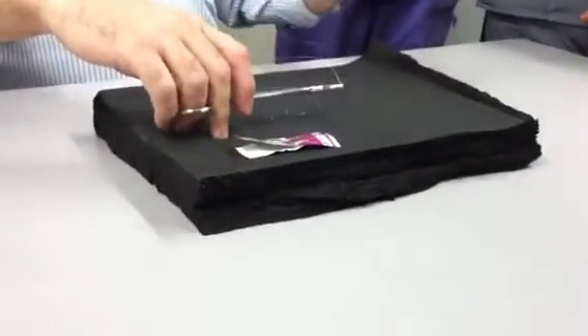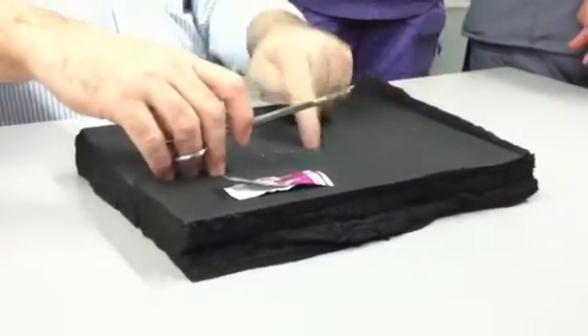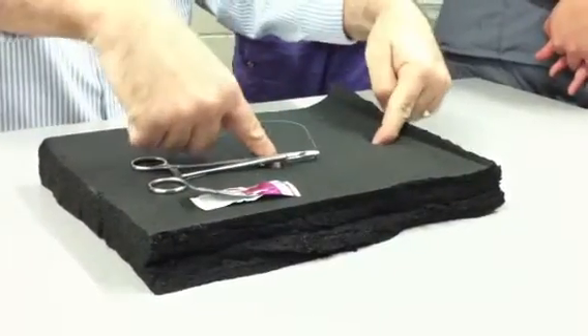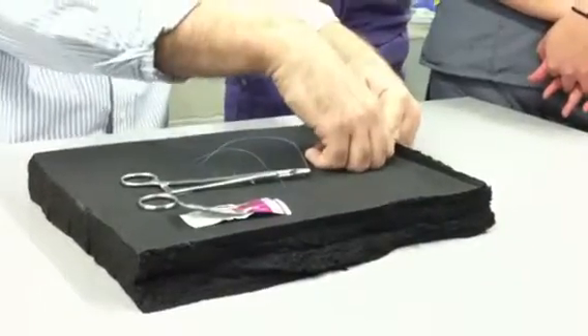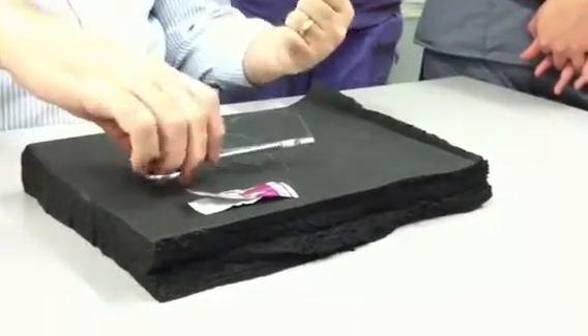I'm going to work my way from right to left. We're all right-handed, so we're always going to start on the right side of the incision. If my incision's here, I'm starting on the right side — I'm not starting here, I'm working my way right. So incision's here to here. I don't want to start at this far end. My hand is in the opening. I want to close, so my hand's always over the closed incision. So I'm always going to be working right to left.